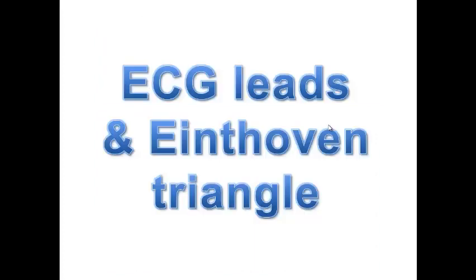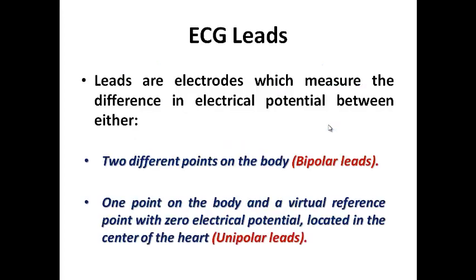Now we are going to speak about another issue that sometimes may be difficult for some doctors to understand, but this issue is very important, especially for cardiologists. If you want to understand the issue of the ECG axis, you need to understand the Einthoven triangle. If you need to understand the ECG leads and how each lead can see the electrical activity of the heart, you need to understand this.